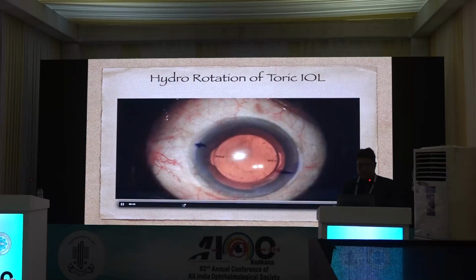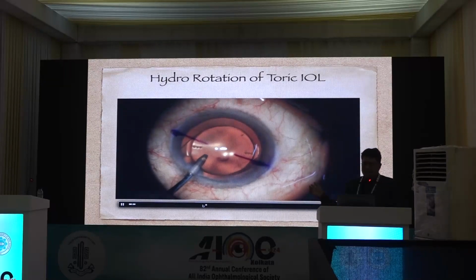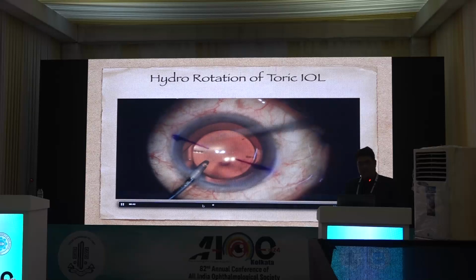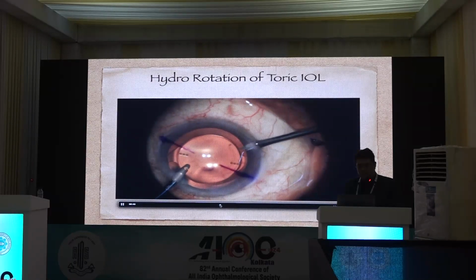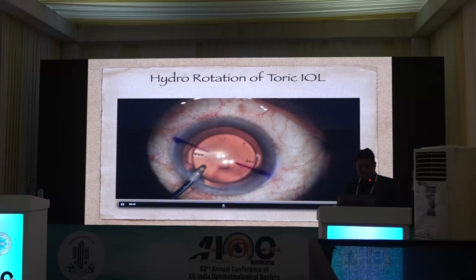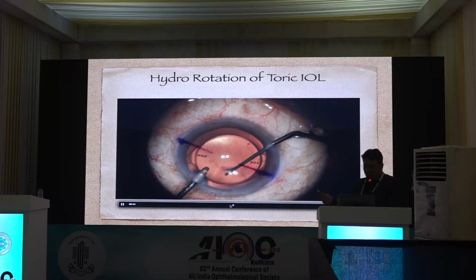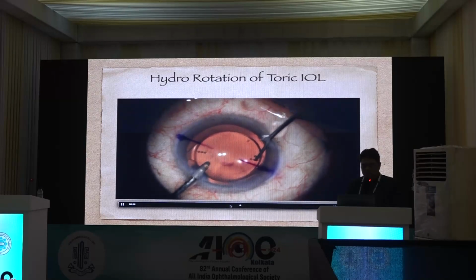And after marking, this is the 14th day, that is 2 weeks after the surgery. I go ahead and put an irrigation cannula through the side port. I opened up the same side ports there and use a Kuglen hook. I go beneath the anterior capsular margin and separate it from the IOL.